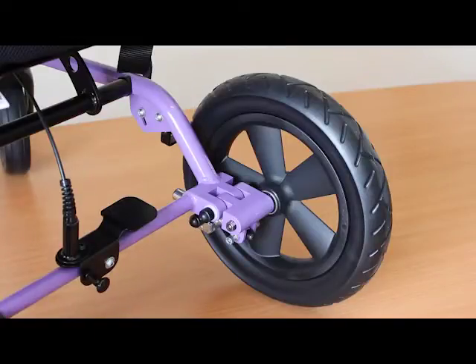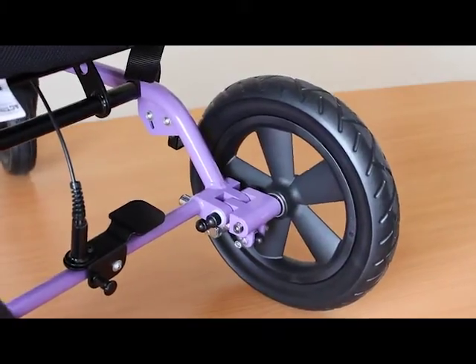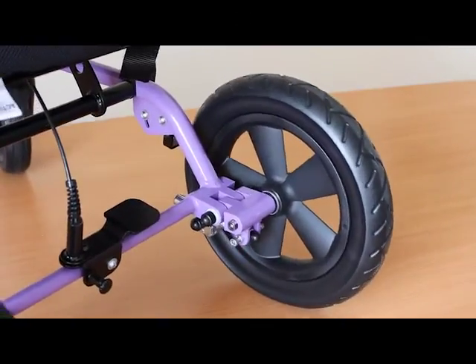One of the unique features on the Corgi Sprint is the independent suspension. Each wheel has its own mechanism so that when going across rough ground, the strain is taken up as you can see.